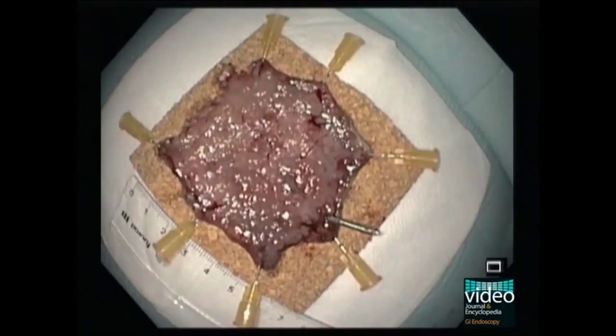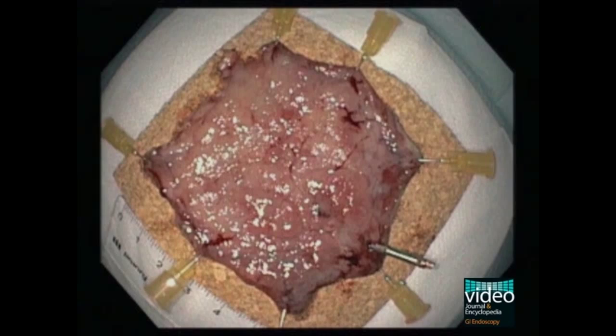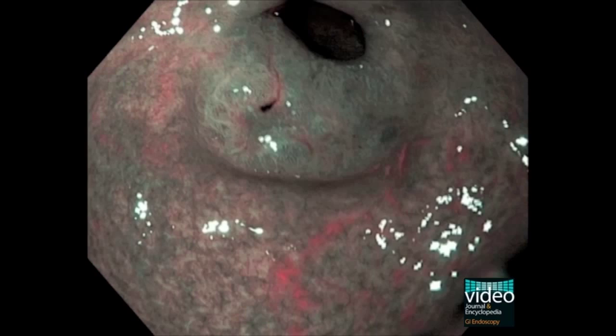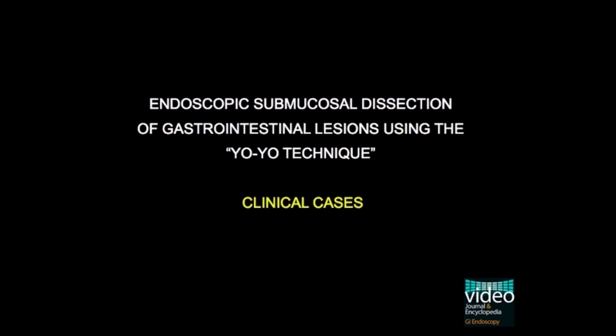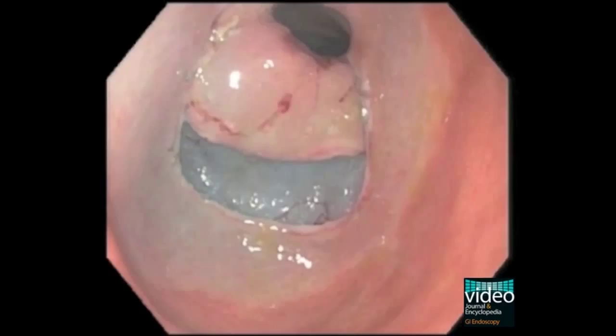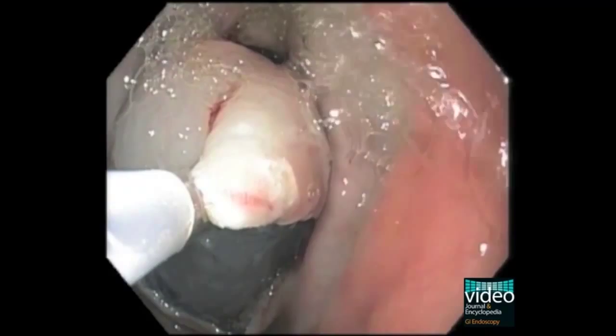The presence of the clip in the specimen permits a precise anatomico-pathological orientation. Now some cases using the yo-yo technique in different contexts are presented. This is a case of a patient with a dysplastic lesion in the pylorus. In this region, there is a tendency for the partially resected specimen to curl, hiding the submucosal space or to move inside the duodenum, hampering access to the distal luminal side.